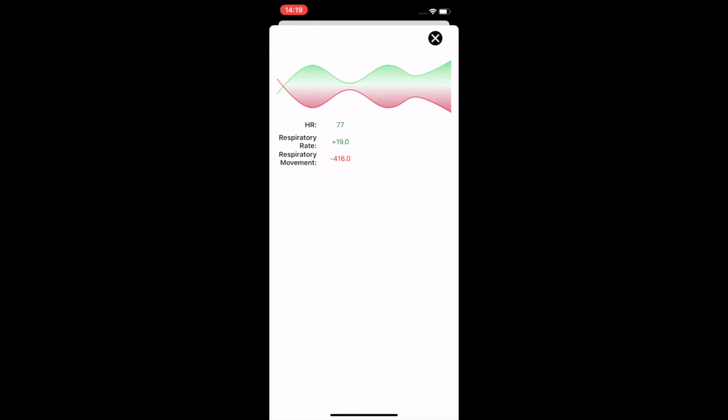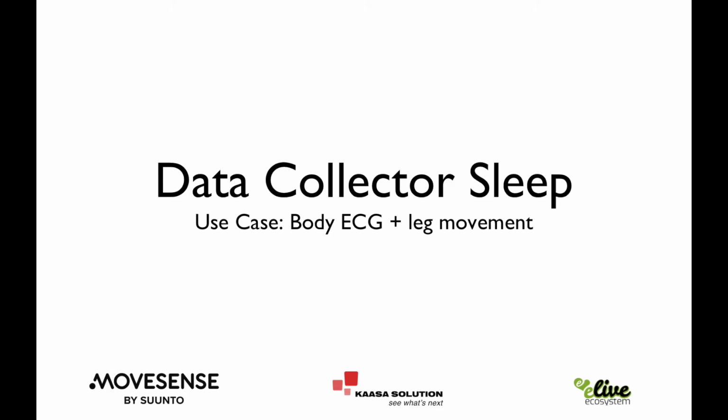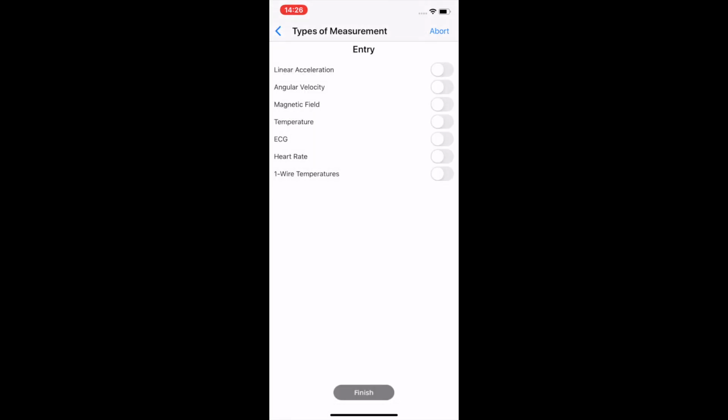to Data Collector Sleep. We take another use case where we add the body ECG through a breast belt and add also Movesense to the legs, so both legs. We take 3 Movesense sensors, just add them to the project, choose linear acceleration, angular velocity, and when we want to have that from a breast belt, also ECG.